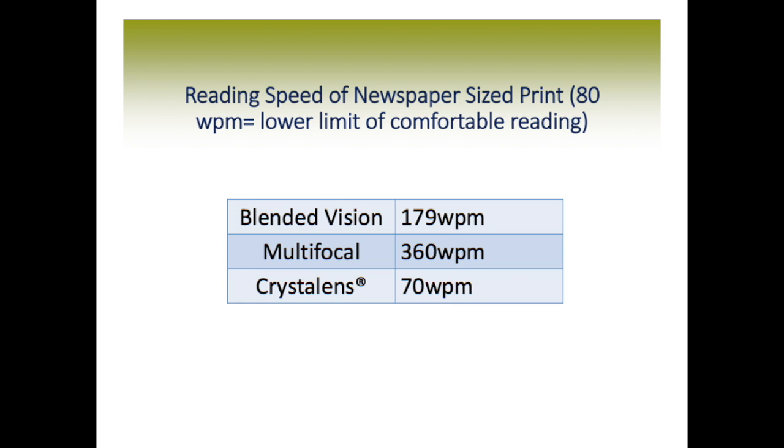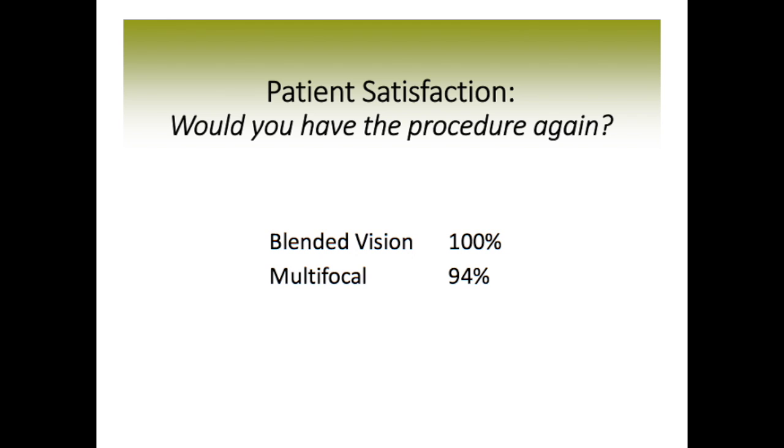Okay, so we have seen that the multifocal lens does really good at close, and some patients may require the ability to see very small items and read it very fast, and don't mind some difficulty seeing the computer or moving up a little closer to the computer, and that may be a fine option for them.